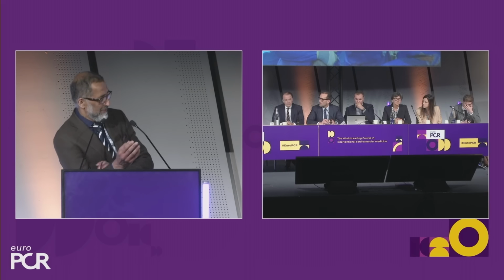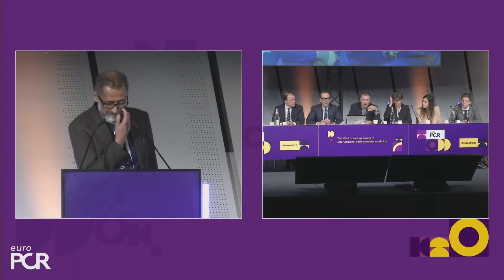If in fact there's some crowding on one side, so the crowns on one side look wide open, on the other side they're all close together, all the peaks are close together, then something's not quite right. It's probably that the valve hasn't fully expanded there. If you've got a very high valve in that situation, I'd probably recapture and put it lower because there's more tension than I would want. If it's a lower valve and I don't want to move it again, that might be one where a balloon might be needed just to push those crowns out a bit further. Okay, very clear. Thank you.